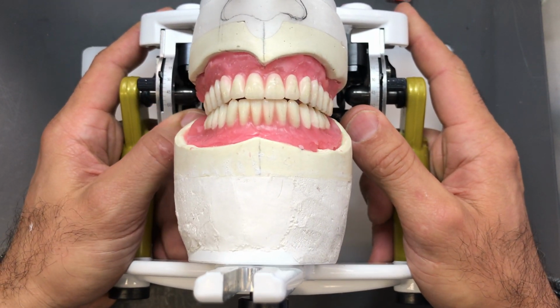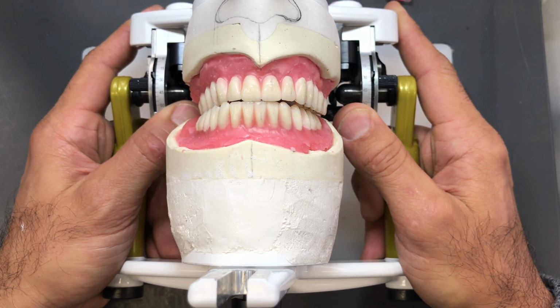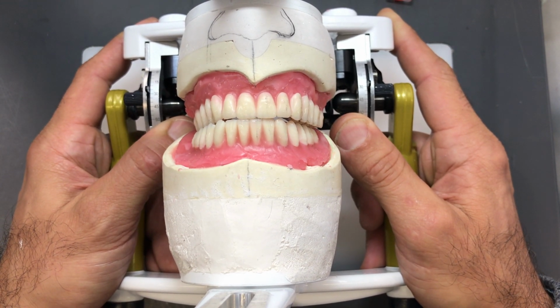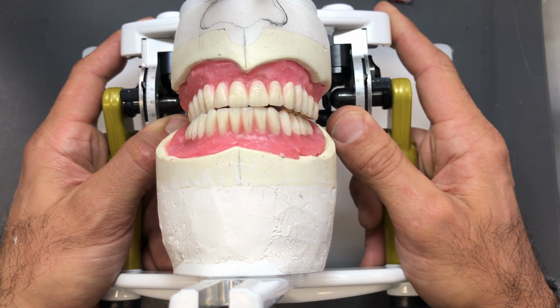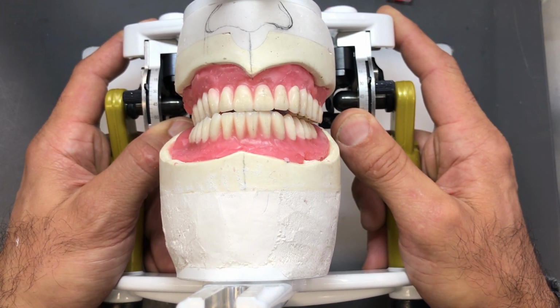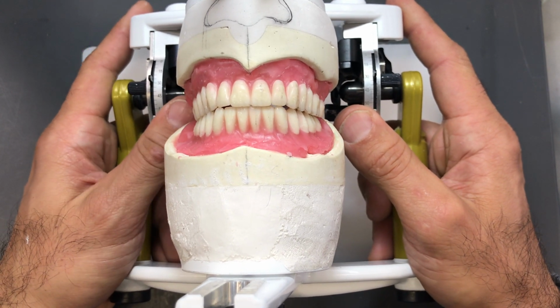So when I move my articulator to simulate a right working, I still have contact with my posterior teeth on the right side. I still have my balancing contacts on the left side, but also now I have incisal contact. I'm missing a bit of incisal contact between 1-2 and 4-2. I can go back and tweak that. And now we check the other side.